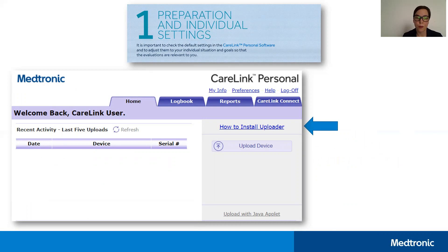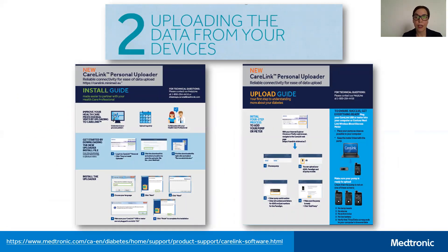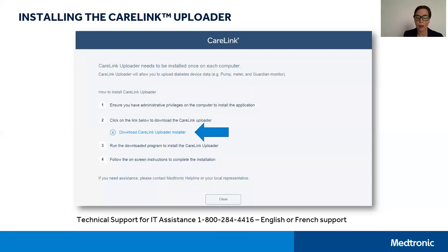Now you're ready to install the uploader. From your homepage, click on how to install the uploader. These are the two PDFs that I recommended you download at the beginning of this video — now might be a good time to do so if you haven't already. Clicking on how to install the uploader will bring you to a screen which will walk you through the process. This is a one-time process and you'll need to have administrative privileges on your computer in order to proceed. Click on Download CareLink Uploader Installer and run the downloaded program to install the CareLink Uploader.